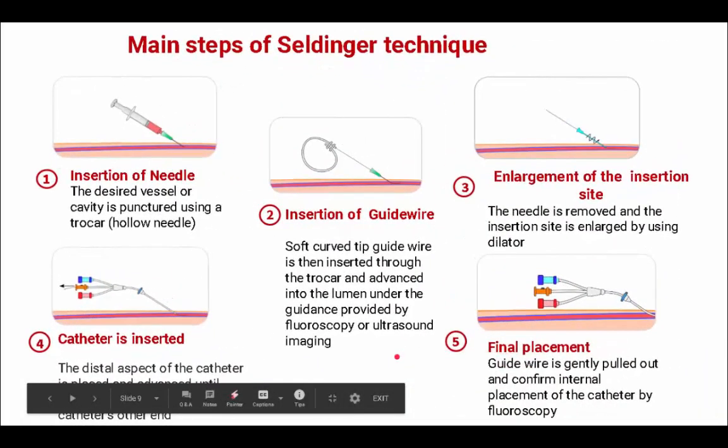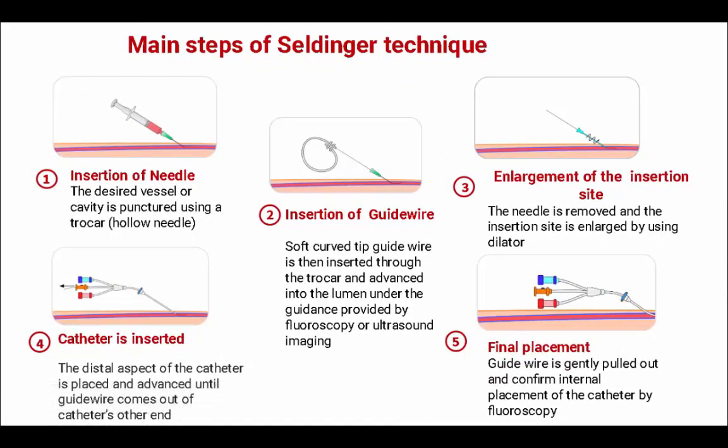Now I would like to talk to you about the Seldinger technique. The Seldinger technique played a huge and crucial role in the development of angiography. It enabled radiologists to obtain safe access to blood vessels via catheterization in the least invasive and most risk-free manner.